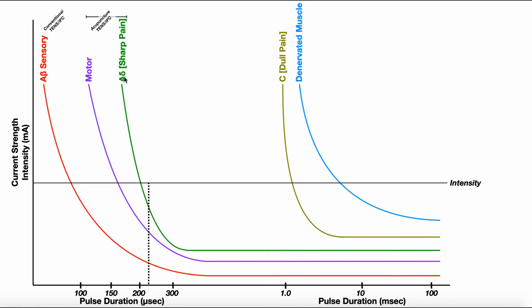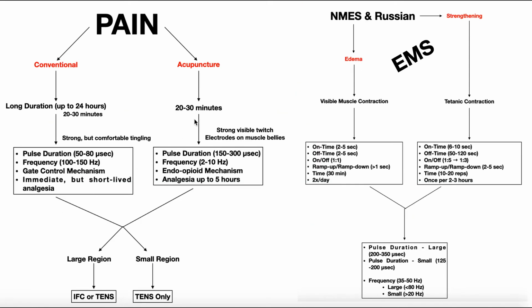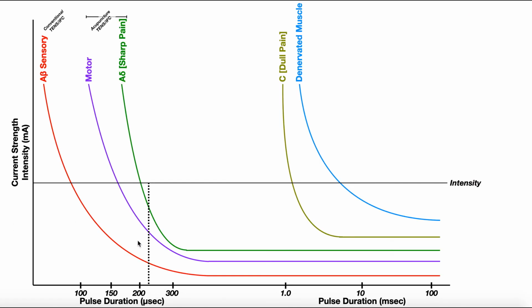A lot of times, patients will actually perceive more comfort if the frequency is higher. So if we're doing acupuncture setting and we had a frequency, let's say, of 2 hertz, well, we could increase it to 5 hertz. You just crank it up and just see if that helps anything. But if the frequency increasing doesn't actually affect the patient's comfort, well, then the obvious solution is drop the pulse duration. And maybe we drop the pulse duration to here. Why might we want to drop it to this point? Well, this is about 198 maybe microseconds, I don't know exactly.